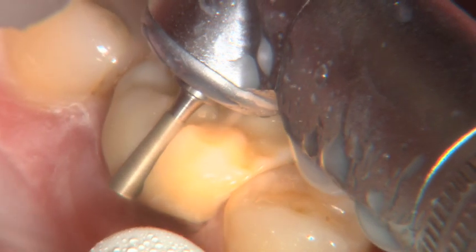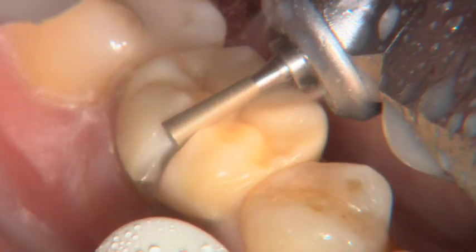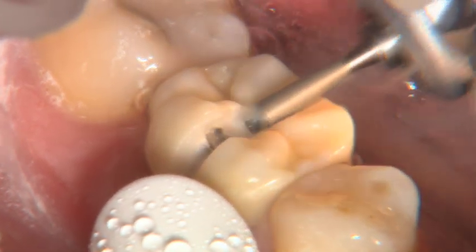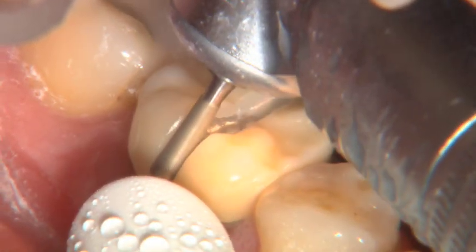You can see I lay it against the tooth and then pull it away — lay it against the tooth and pull it away. Got a lot of water spray going on here, and there's the tooth. You can see the tooth starting to show through. The difference in color between the zirconia and the prep makes it really easy to know when you've cut far enough. In that respect, it's kind of like cutting off a typical PFM crown.